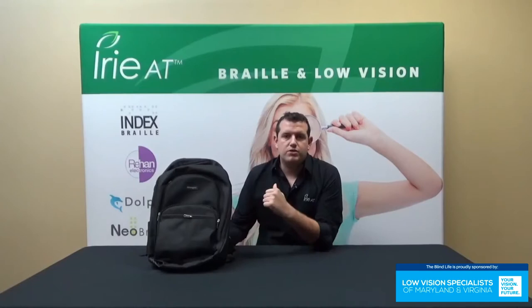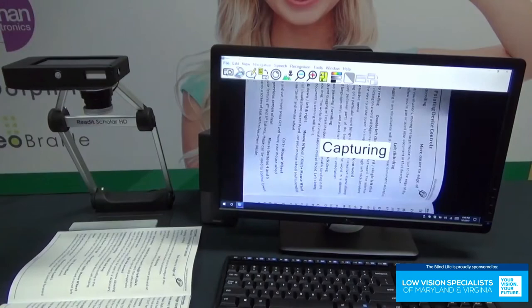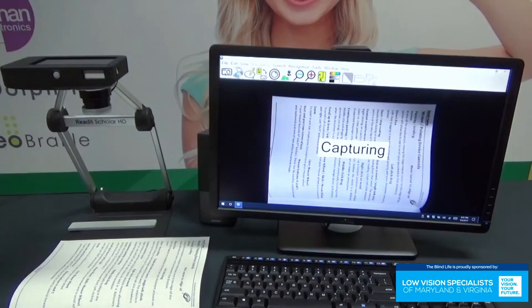Welcome back to another episode. I'm John with Irie AT and today we're going to be taking a look at the Scholar HD. So let's go ahead and get something underneath here to scan. I just have the manual handy, so I'm going to stick that right under there and click the scan button. I'm going to move my document around a little bit, and you're going to see that while I'm moving my document it actually won't capture the image. The reason for that is that it'll wait until it gets a clear image. That looks pretty good — I'm going to let it go, and as soon as I do that it's going to capture my document. And that's a nice feature.